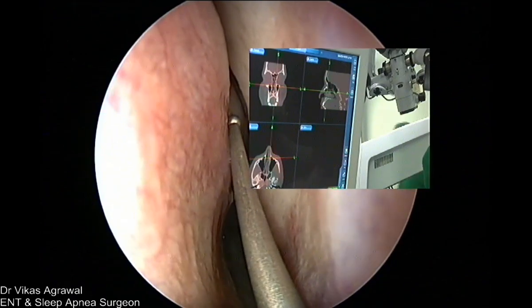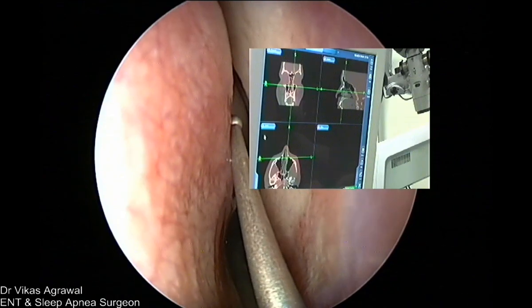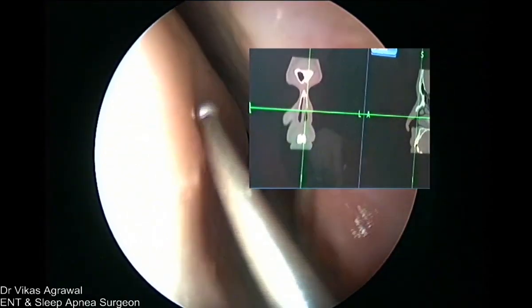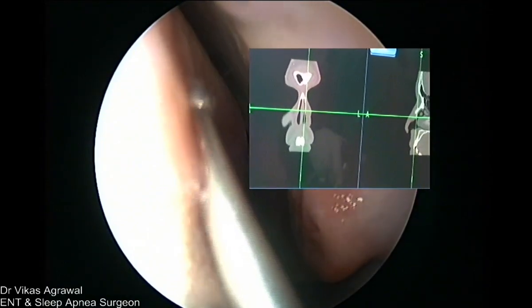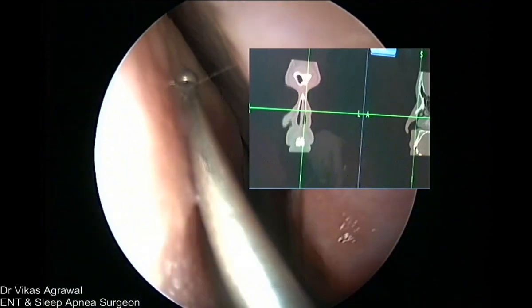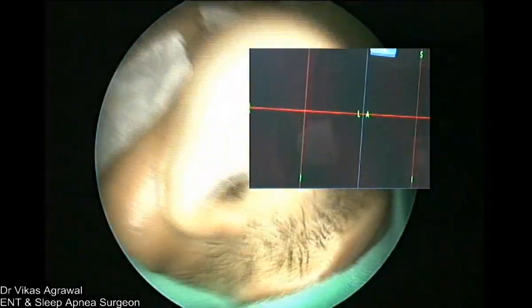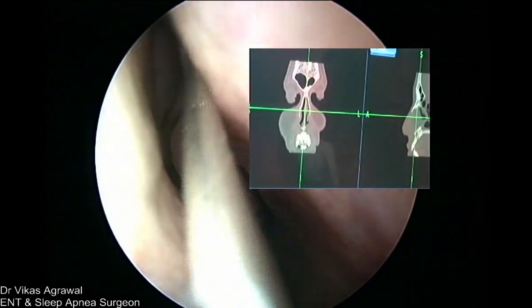Okay, now Sunil, can you focus on the coronal, the upper left corner? Yes, this one. Okay, so what I am showing you is the septum. See, this is the internal nasal valve area. The septum is here. If you do not take care of this part, the patient will not have an open nose because this wall is constant and this is the septum deviated on this side, on the left side. So if you do not tackle the high septum, the patient will not do well, right?